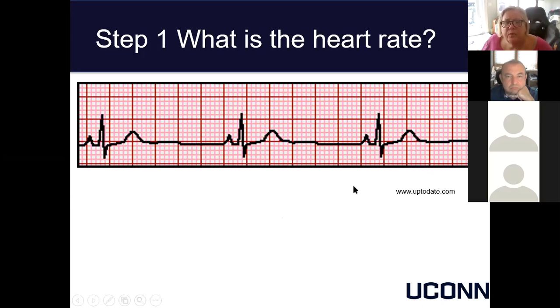So again, here's another rhythm strip. Again, you can calculate the heart rate here.